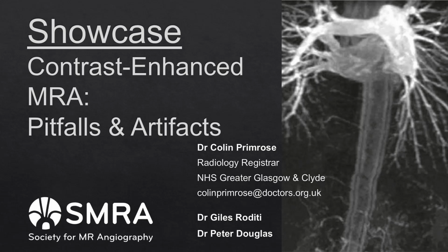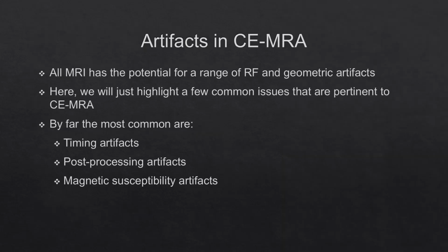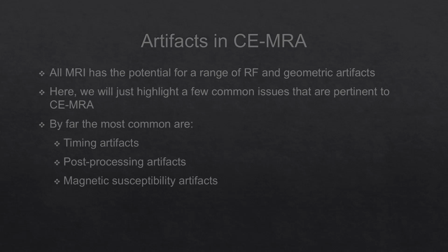Hello, I'm Colin Primrose. I'm a radiology registrar based in Glasgow, Scotland, and this is a showcase presentation on pitfalls and artifacts in contrast-enhanced MRA. So certain artifacts that are pertinent to contrast-enhanced MRA are mostly to do with timing, post-processing, and magnetic susceptibility. So we'll talk through a few of these.